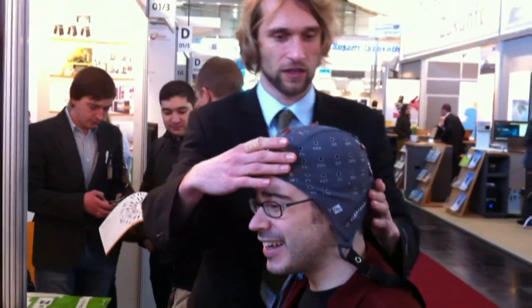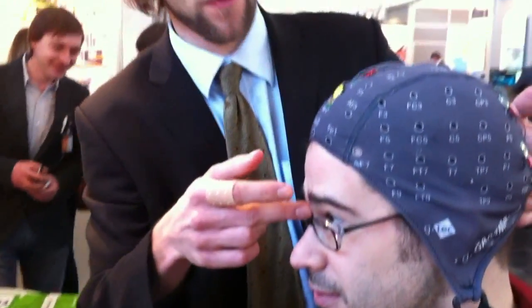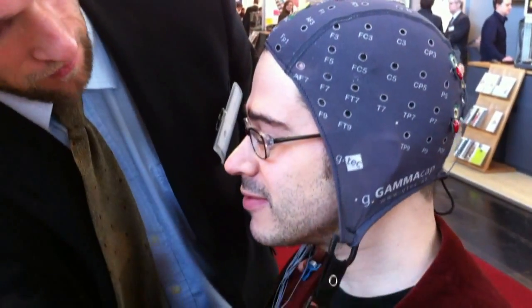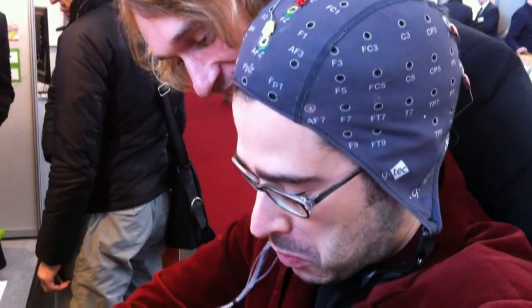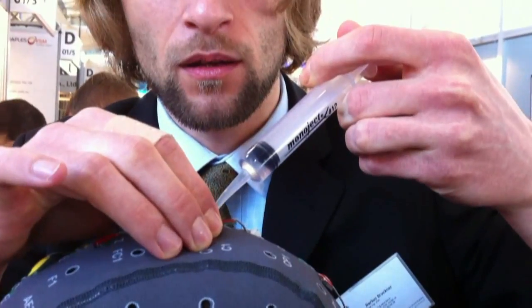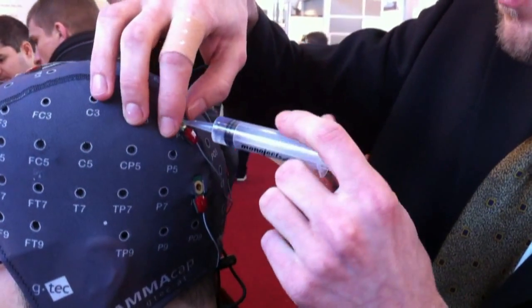What are you putting on me? Now I'm putting on you the EEG cap. So now I have to look for the correct position of the cap. We need the gel to get a good connection between the skin and the electrode so that we can measure the EEG.